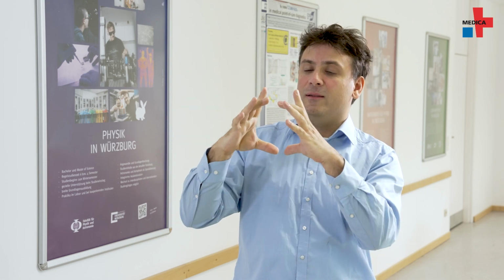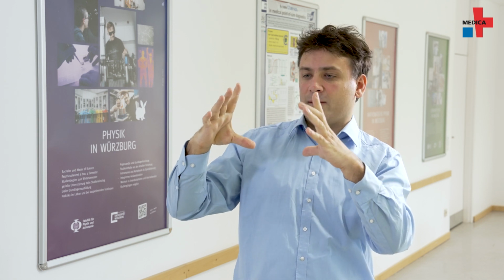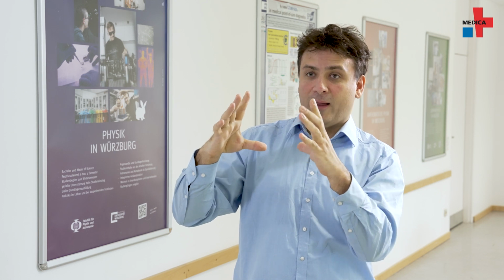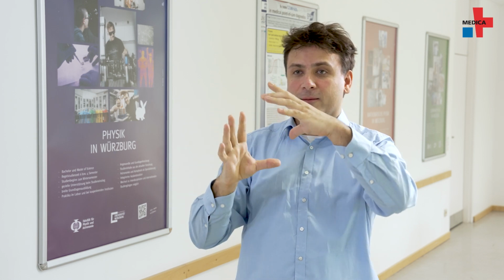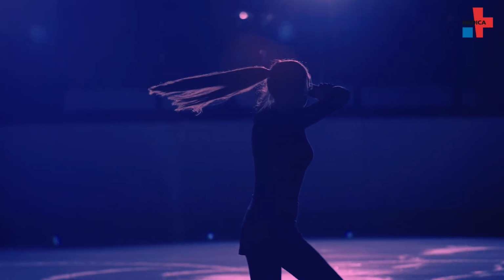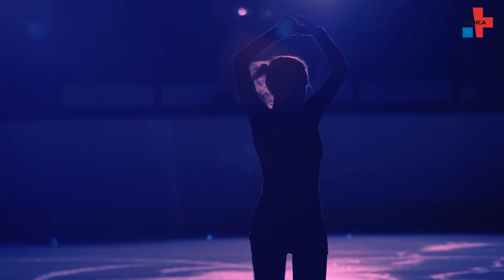And now you can imagine that nanoparticles have a certain size in terms of diameter, and if something adheres to it, it gets bigger. What we do now with an external magnetic field is we wiggle these nanoparticles, we rotate them, so to speak. Now we know this as with figure skaters. With their arms outstretched, they rotate slower than when their arms are on their body. And that's exactly what we see.